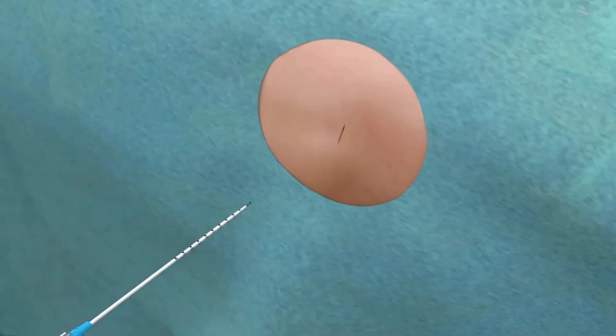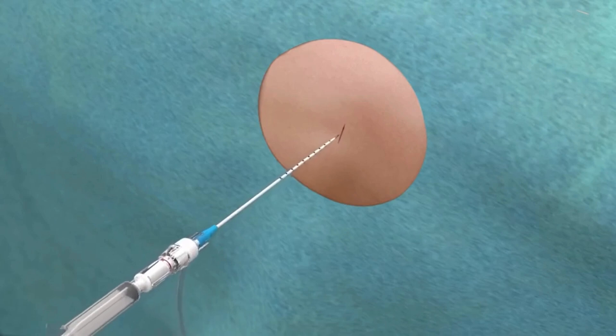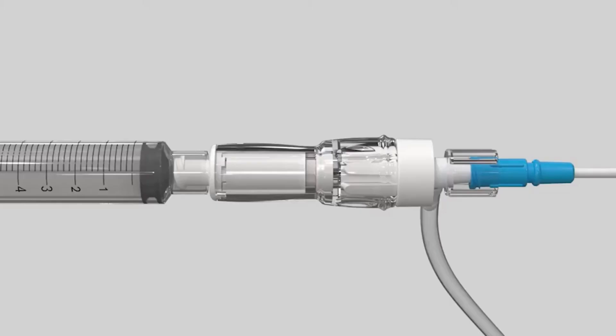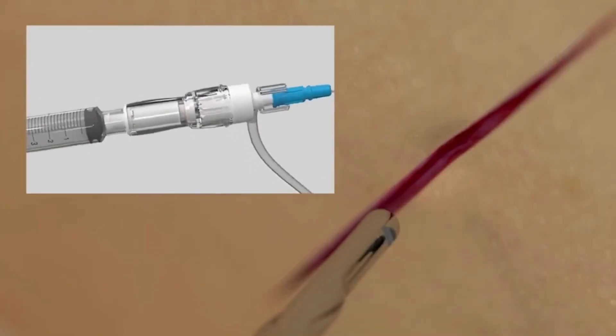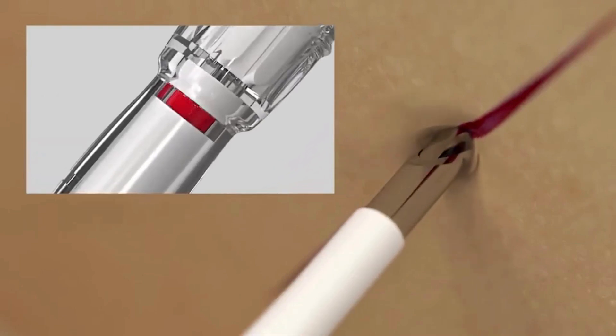Introduce the Safety Centesis device into the chest wall for thoracentesis or abdominal cavity for paracentesis. When anatomical contact is made, the blunt obturator will automatically retract and the sharp needle tip will be exposed. The visual color indicator will confirm anatomical contact by transitioning from a safe white to a caution red.